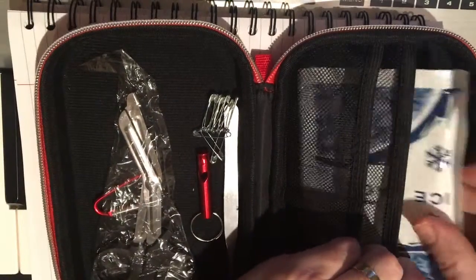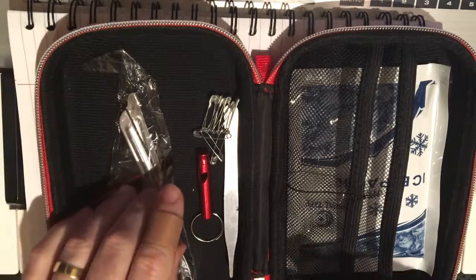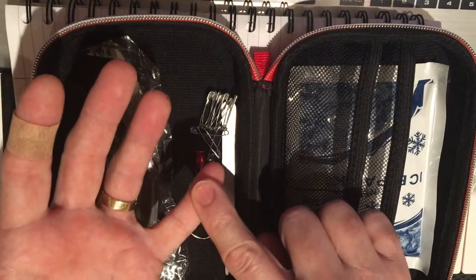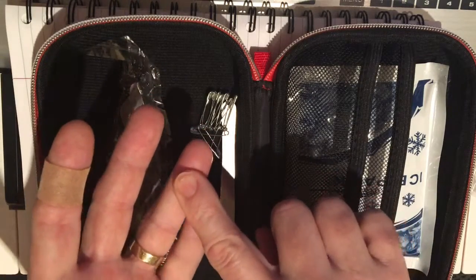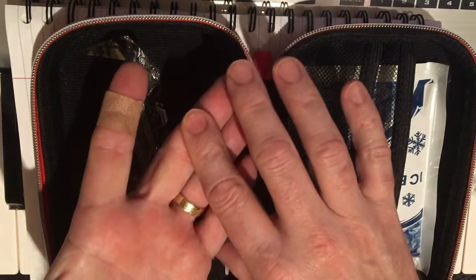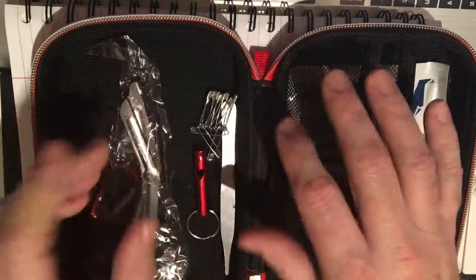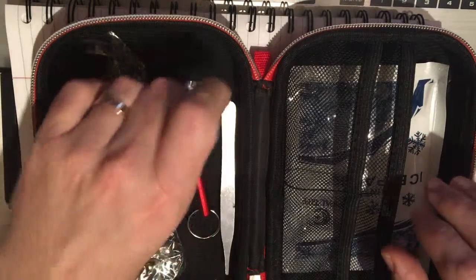So all in all, a pretty good kit for $18. This band-aid has stayed on during the review, so the band-aids are decent. I would add antibiotic ointment as the first thing, a pain reliever as the second, and perhaps some higher quality band-aids with fun colors — superheroes, Disney characters. I deal with kids a lot, and they also brighten up the day even of an adult.